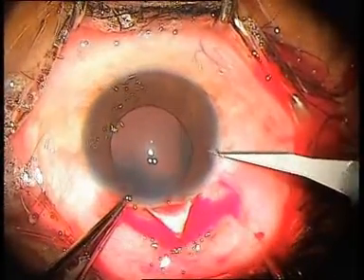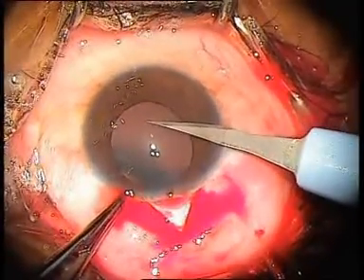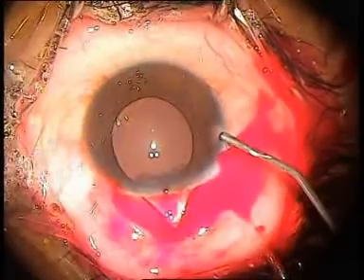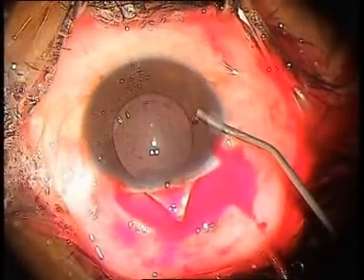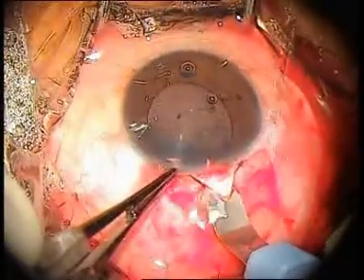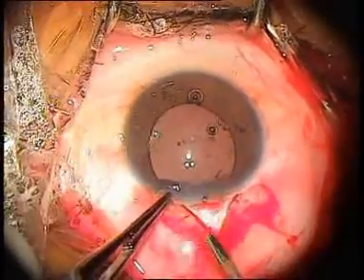A self-sealing beveled limbal stab incision is made before entering the anterior chamber under the scleral flap. Viscoelastic is injected. The anterior chamber is then entered with a keratome just behind the hinge of the scleral flap.